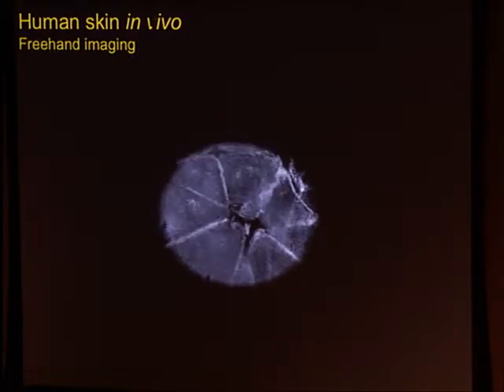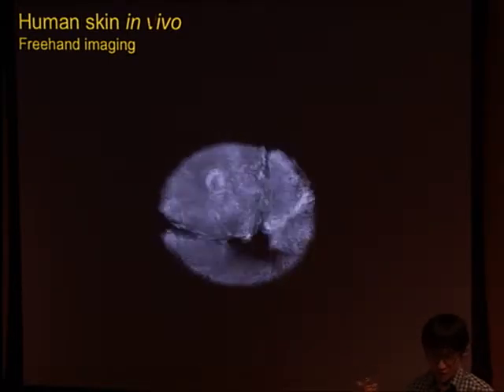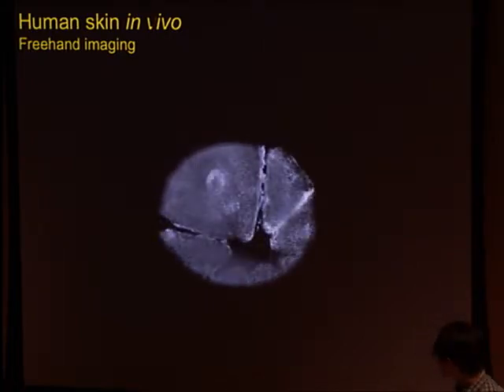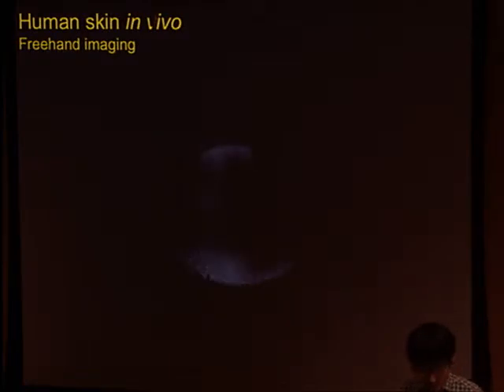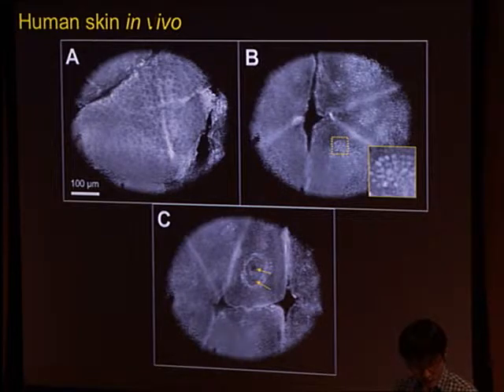You go to another location, melanin deposition again, and things like that. In this particular video, the subject didn't have a skin disease, so you don't really see disease structure. Just to recap what we just saw: keratinocytes, melanin caps, and capillaries are visualized in the confocal image.